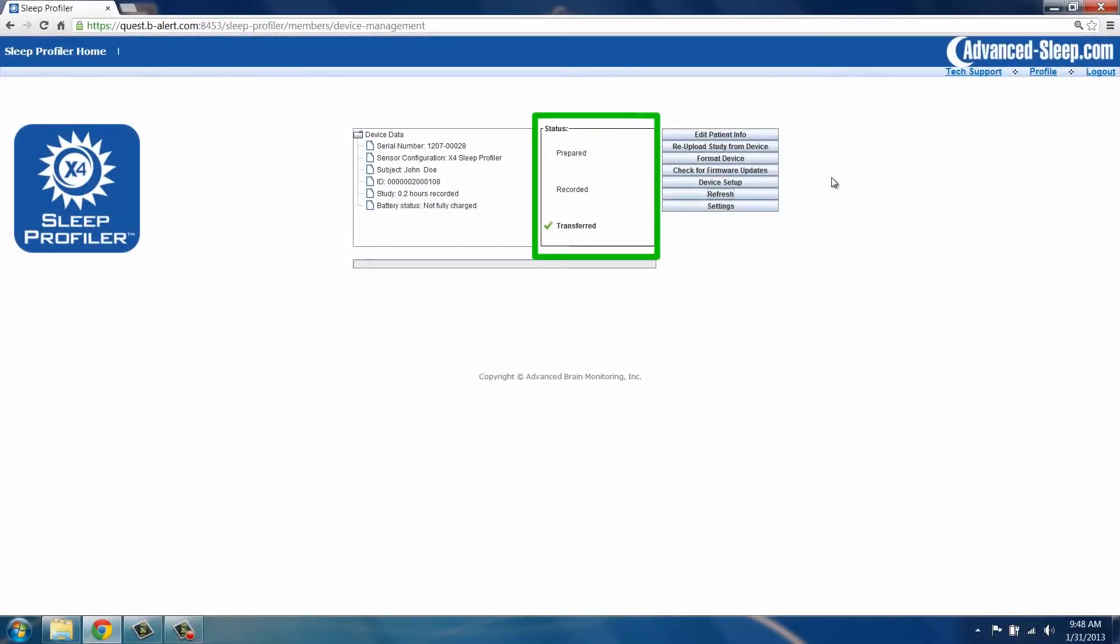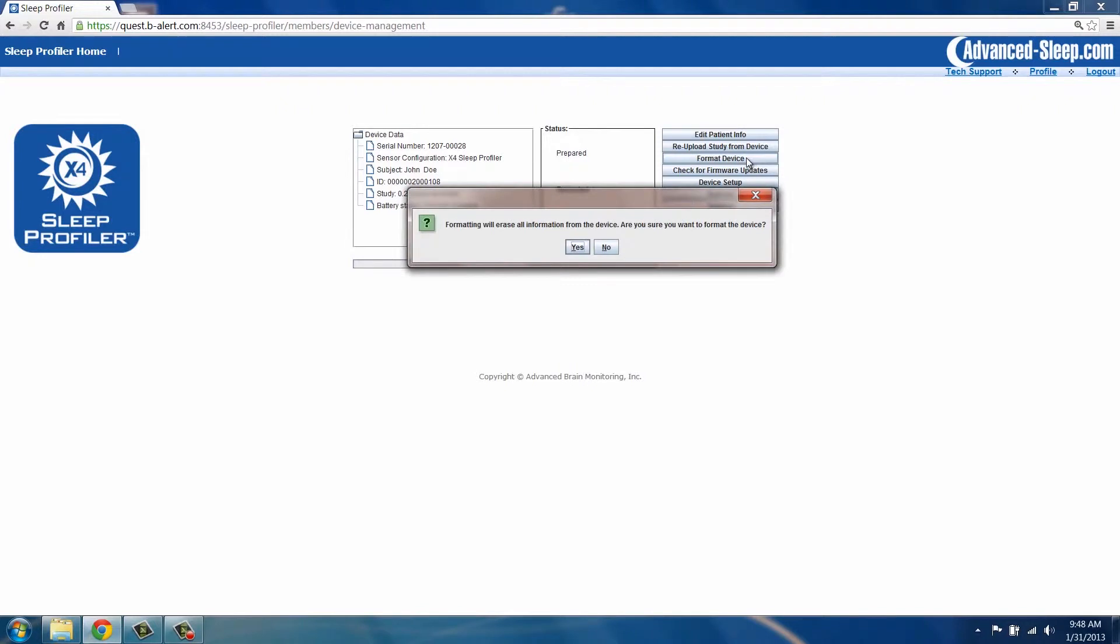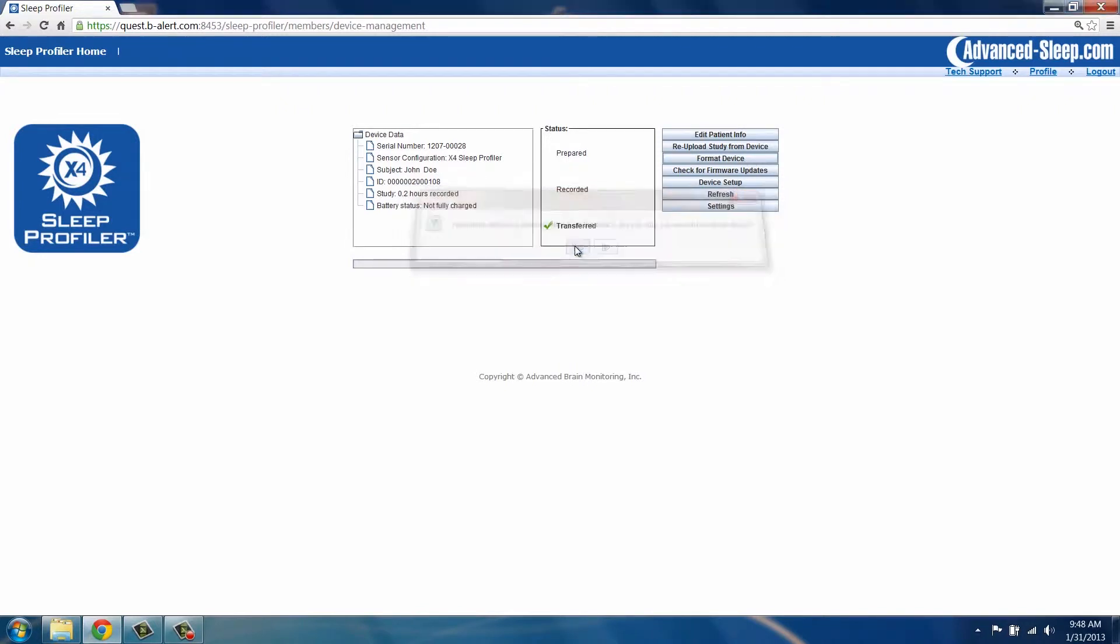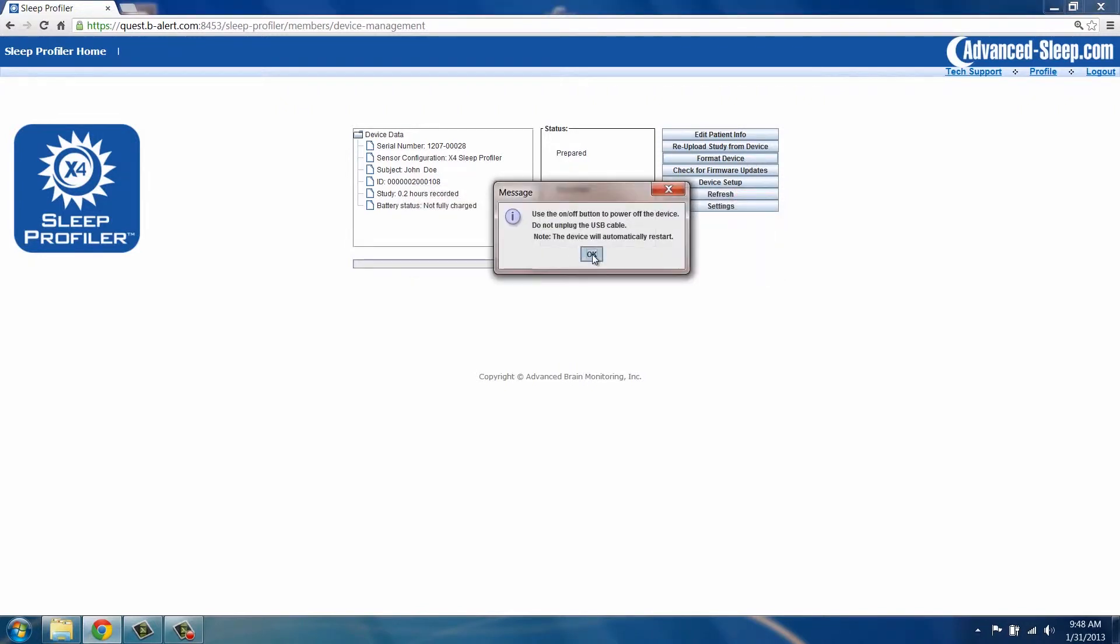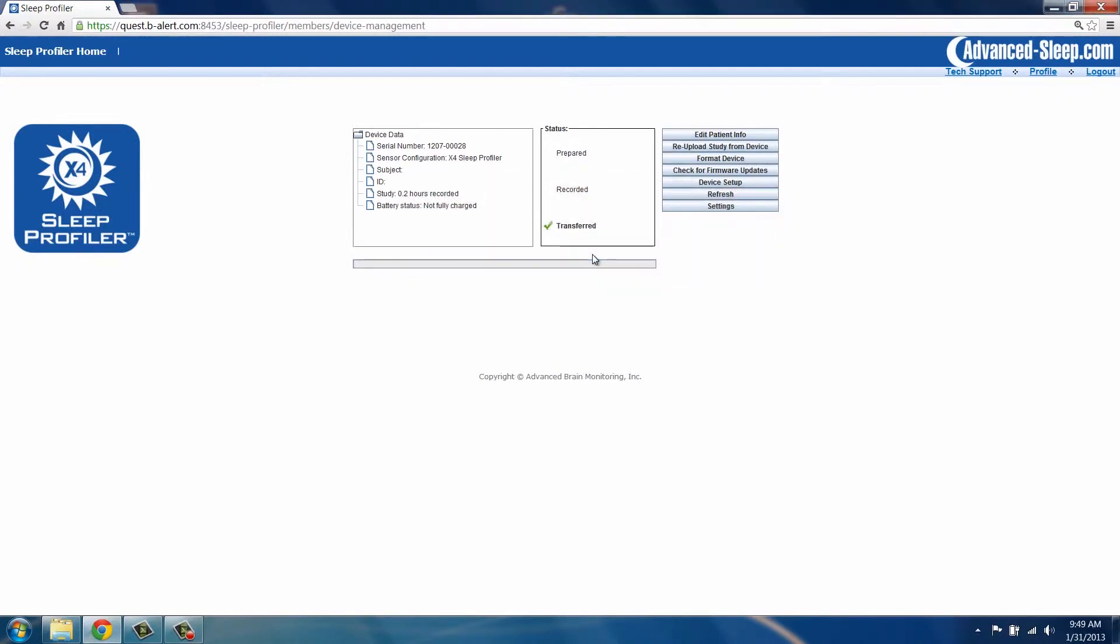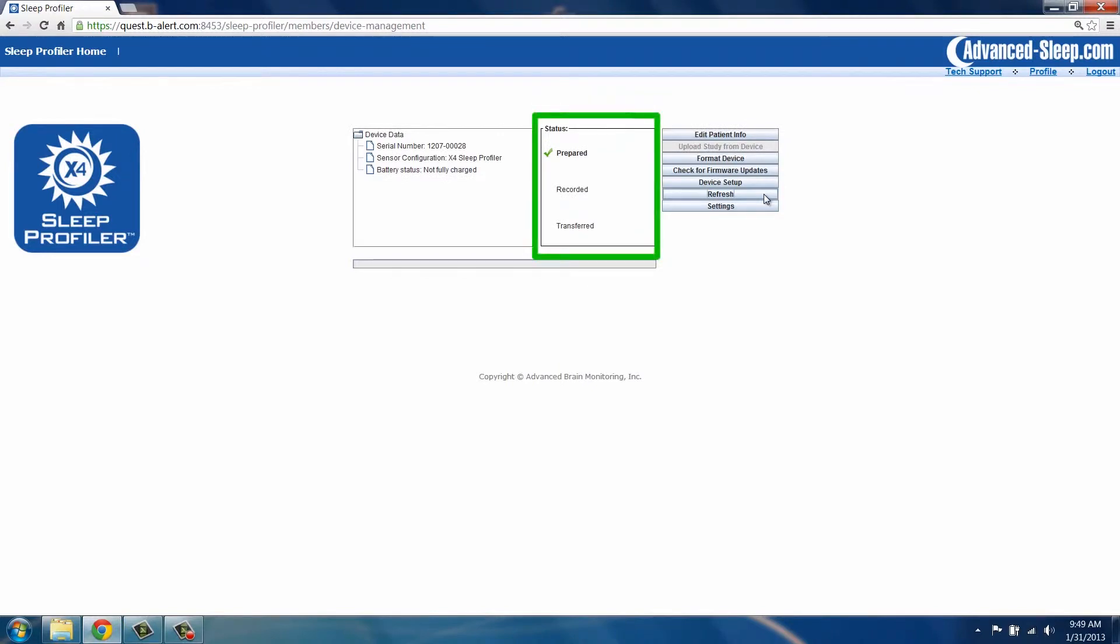If it is not, click the Format Device button and follow the on-screen instructions. After formatting, device status will now be prepared.